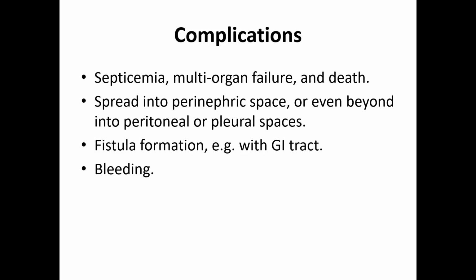Complications: septicemia, which may cause multiple organ failure and sometimes death. Spread into the perinephric space due to leaks through your nephrostomy tube, or into the peritoneal or pleural cavity. Fistula formation, GIT, or infections of the surrounding structures, and bleeding.